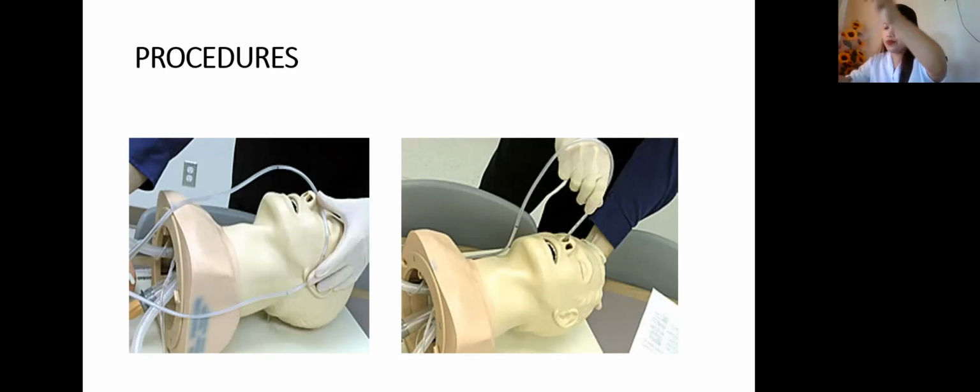And then, usually, when you are putting the lubricant gel in the tube, it's about 4 to 8 inches of lubricant gel inside the tube. So you will put like that, and then you will insert it slowly. So why do we need to put a lubricant gel? Most of the patients, when you check the nostril, it is very dry.